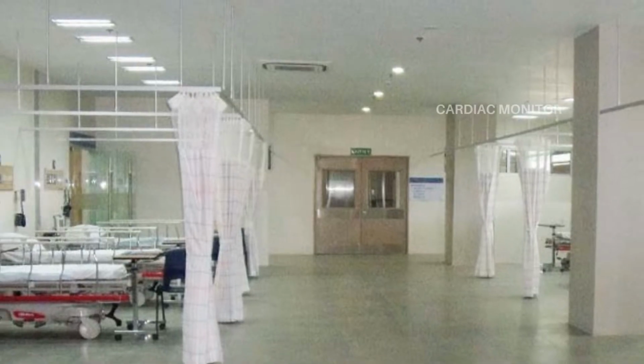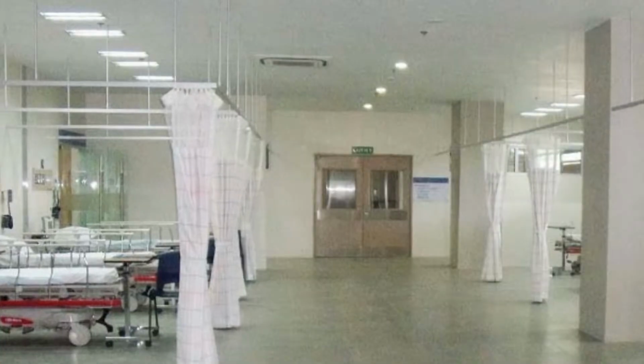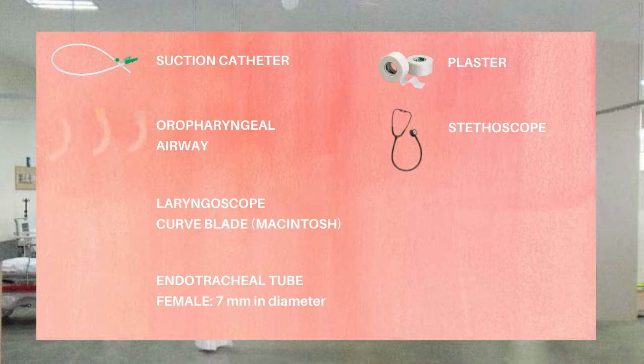For the intubation, materials should be prepared. For the monitoring of the patient, prepare a cardiac monitor and pulse oximeter. For the airway, prepare the following: suction catheter. Prepare an oropharyngeal airway. For the laryngoscope, use the curved blade because we are dealing with an adult patient. Then the tracheal tube with a 7 mm diameter.